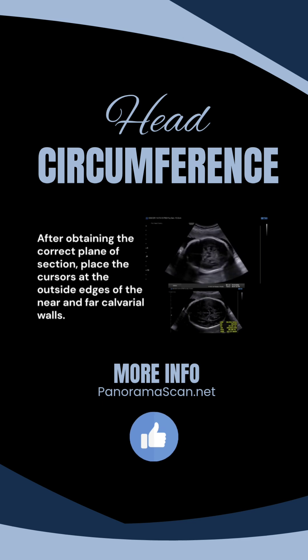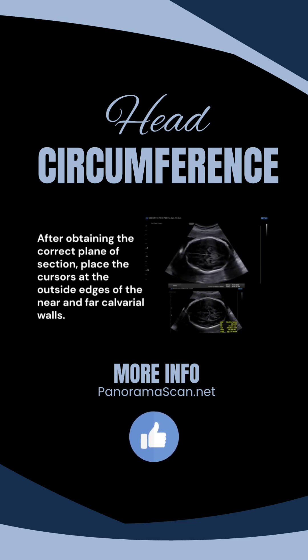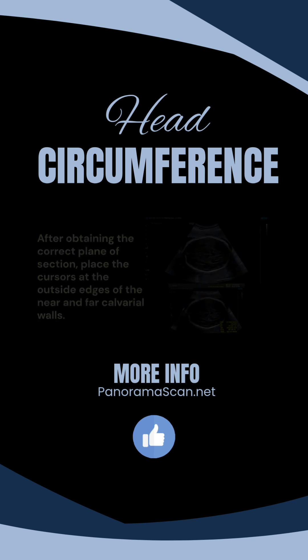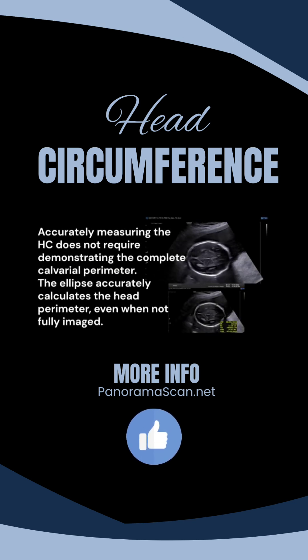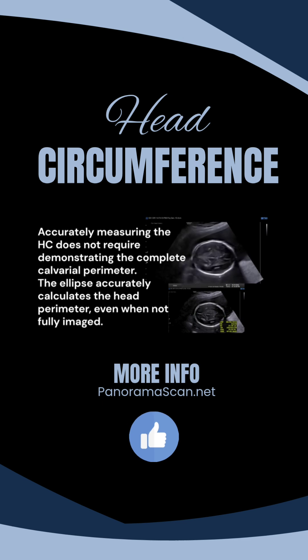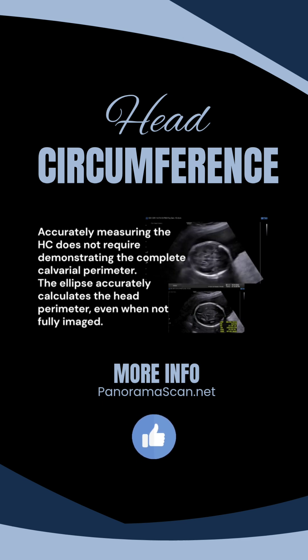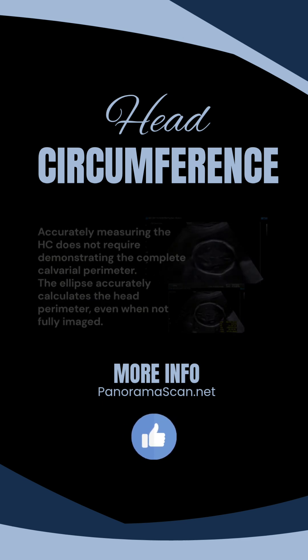After obtaining the correct plane of section, place the cursors at the outside edges of the near and far calvarial walls. Accurately measuring the HC does not require demonstrating the complete calvarial perimeter. The ellipse accurately calculates the head perimeter, even when not fully imaged.